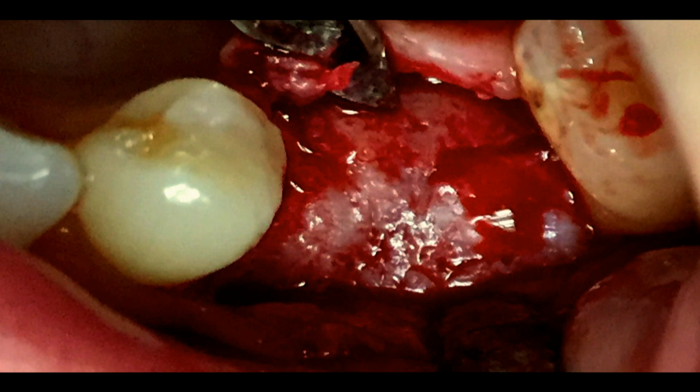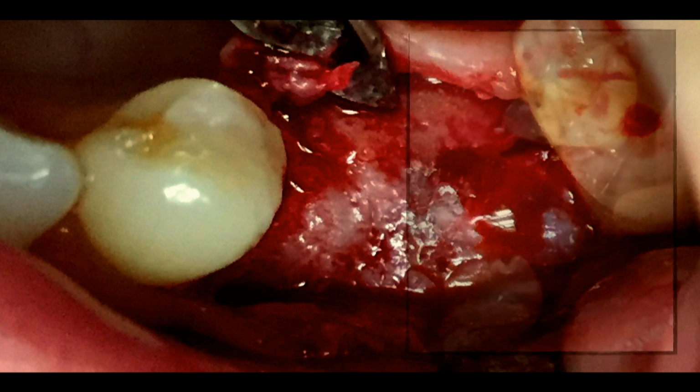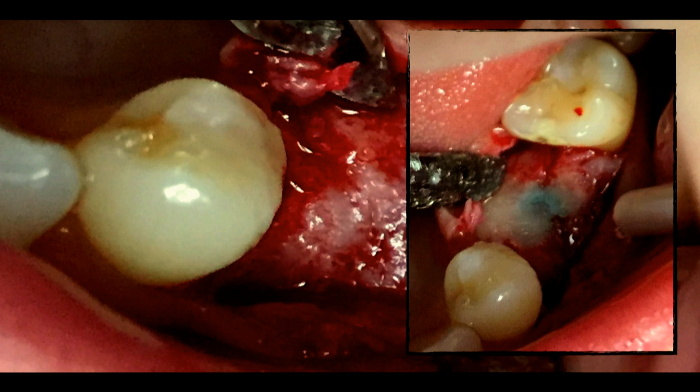I'll tell you, the way I started using it was I took over working as an associate for one of my very good friends, Dr. Reza Modares. And every case that I had to uncover of his implant would look like this. I'd look in the notes, there was an implant placed, the immediate placement, and I would go to do the uncoveries, and everything was covered by bone, just completely covered by bone. I'd have to be drilling away using a stud finder to find the implant. And finally, I would go back and look at the chart. In every case, he was using Amnion-Chorion. So that really turned me on to it from the beginning, and that was about 10 years ago.